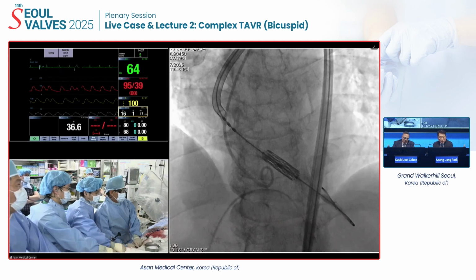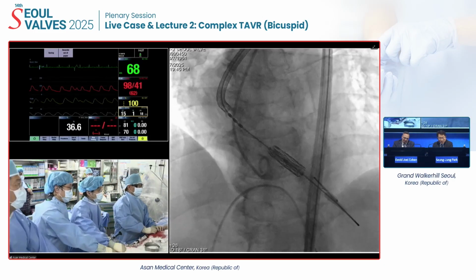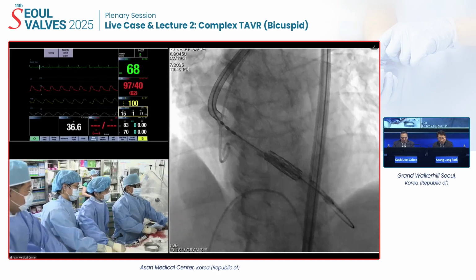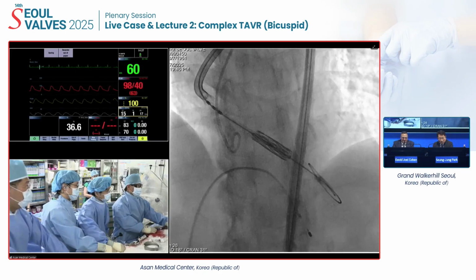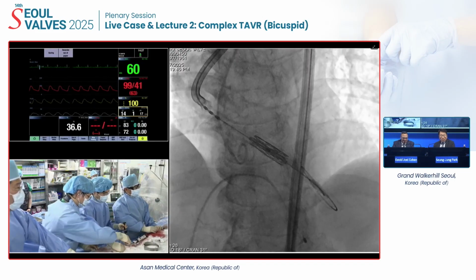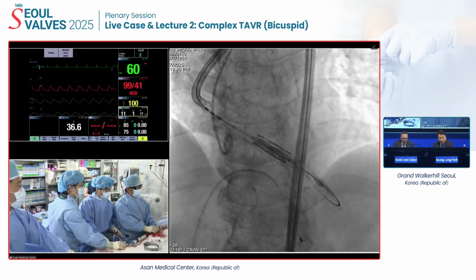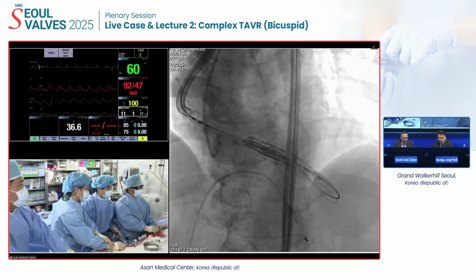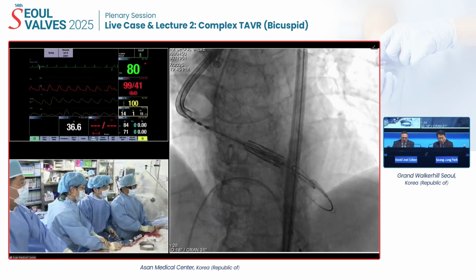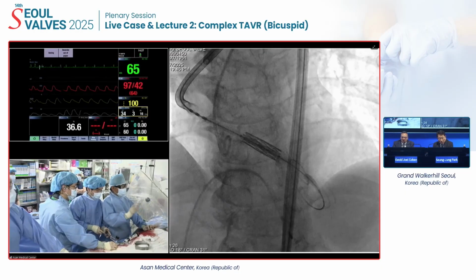Six, nominal. Three. It's going to look funny because you don't have a three-leaflet, three-cusp view. Yeah, that is a big problem. To make sure of the best implantation angle, we need multiple projections. Are you in an almost AP view here? This is the selected view for best implantation. What's the angle? Ready? All right.